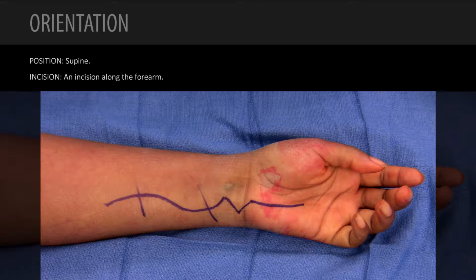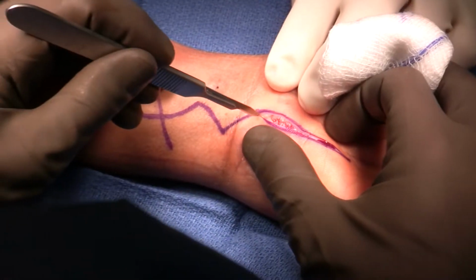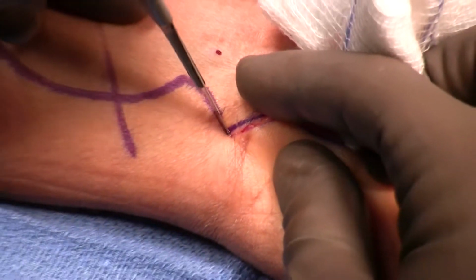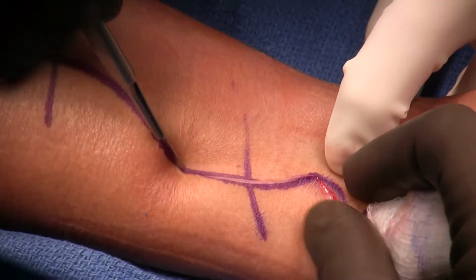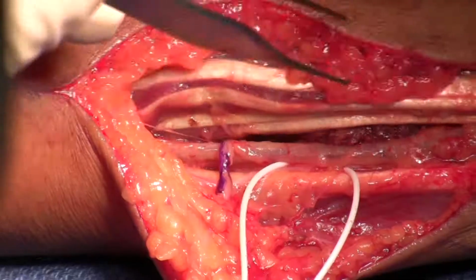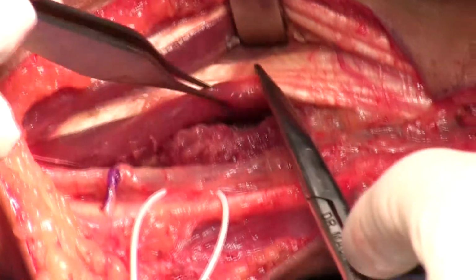So we have the left hand, and in this case we're doing our nerve transfers for the ulnar nerve high injury, with the motor transfer of the anterior interosseous to the deep motor branch of the ulnar nerve and the sensory transfers off of the third webspace of the median nerve. So that will look after sensation and intrinsic motor function, but this profundus tenodesis that we're going to show you in this video will give us the extrinsic motor recovery promptly for this high ulnar nerve injury.